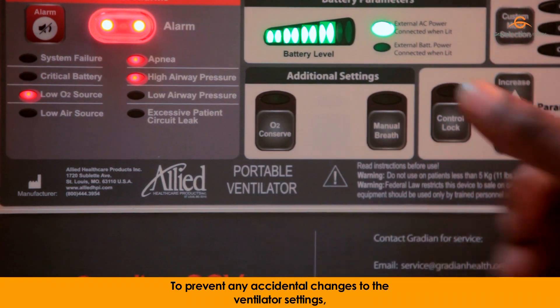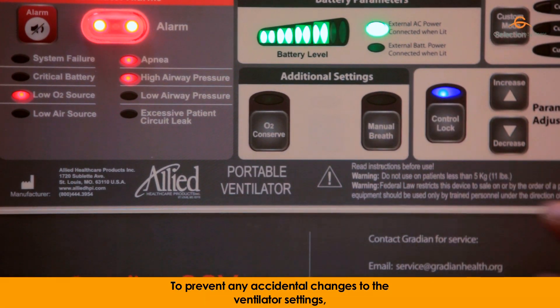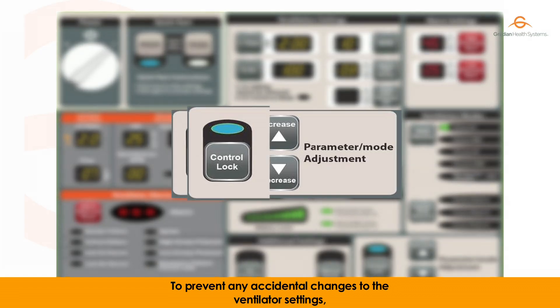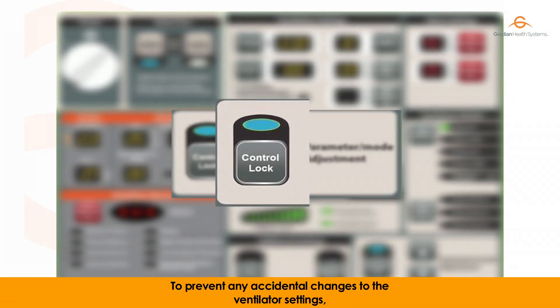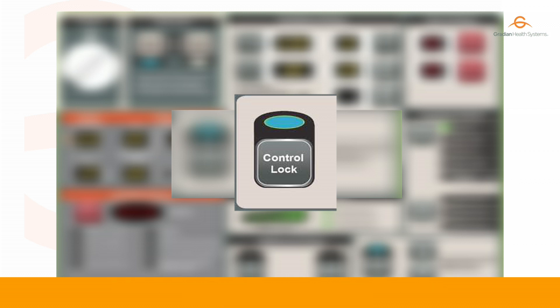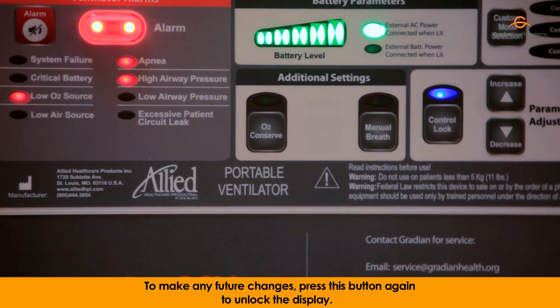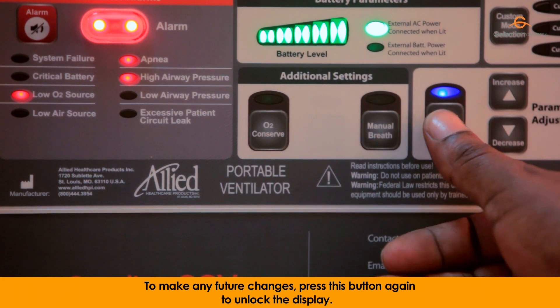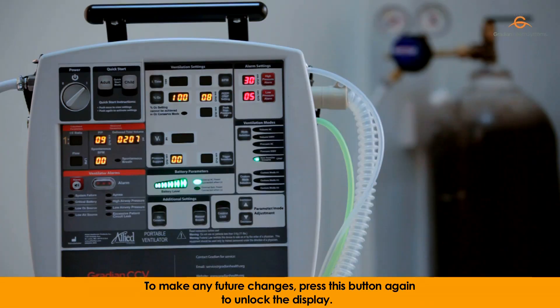To prevent any accidental changes to the ventilator settings, lock the front panel controls by pressing the Control Lock button, ensuring the blue light is illuminated. To make any future changes, press this button again to unlock the display.